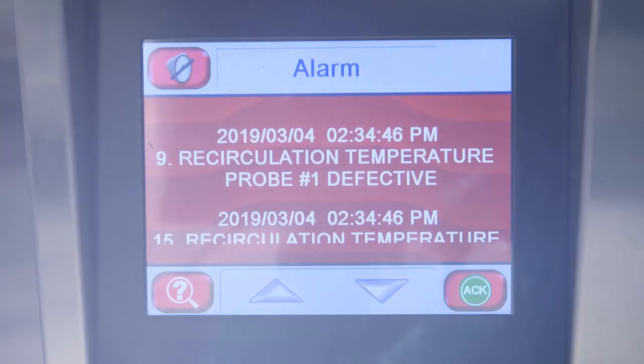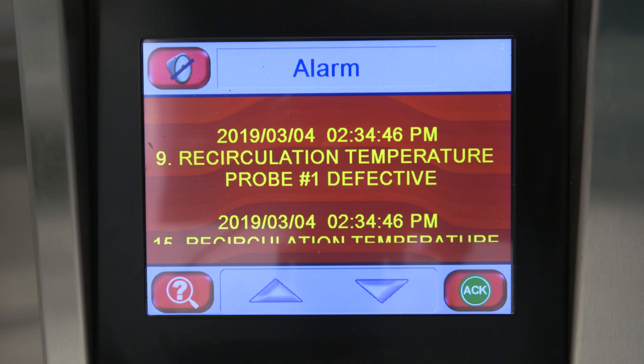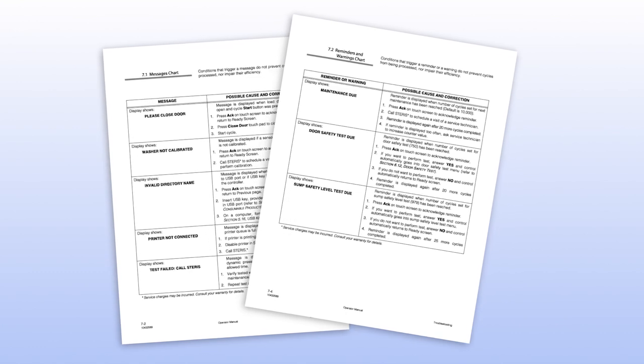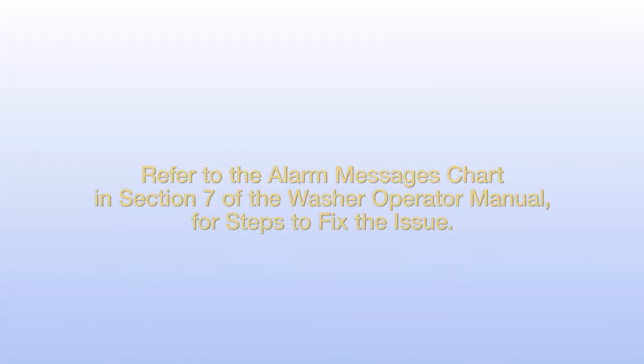The washer is equipped with a messaging system to communicate to the technician that certain conditions may exist. If a reminder or other message occurs, refer to the messages and reminder charts in Section 7 of the Operator Manual to address the notification. When a problem occurs with the washer, an audible alarm sounds, the screen turns red, and shows an alarm message. If an alarm occurs, press the Ack button to acknowledge the alarm and silence the buzzer. Refer to the alarm messages chart in Section 7 of the washer operator manual for steps to fix the issue.